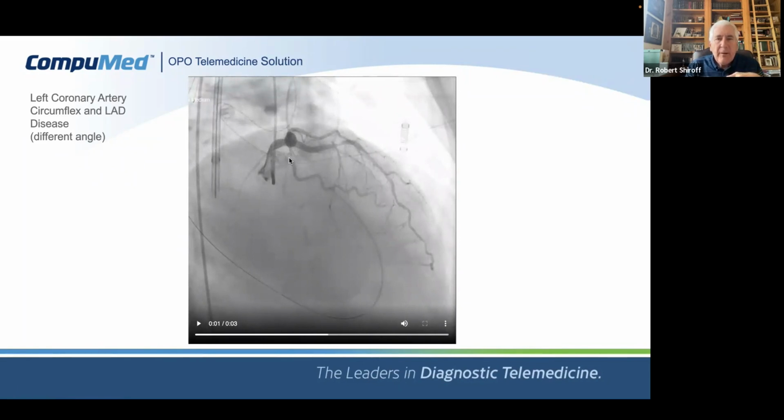This is that area of narrowing that was so far down the artery. Now you can just about see it, but it's way up north because of the angulation. And here they're trying to look more at this anterior descending. And it was a good angiographer that defined that narrowing, and it's a significant narrowing as well. So this heart was not a transplantable heart.